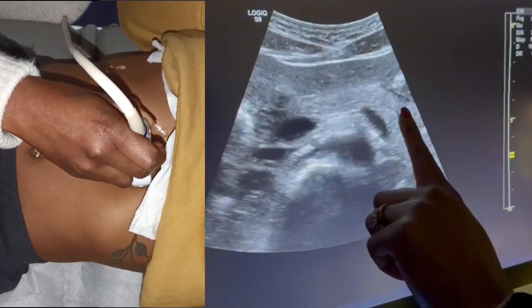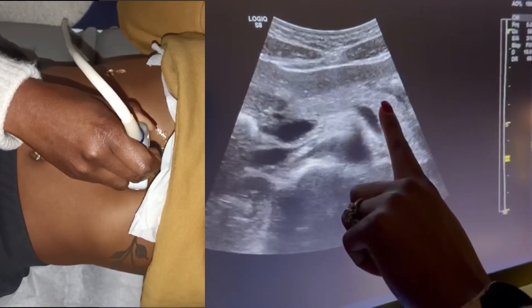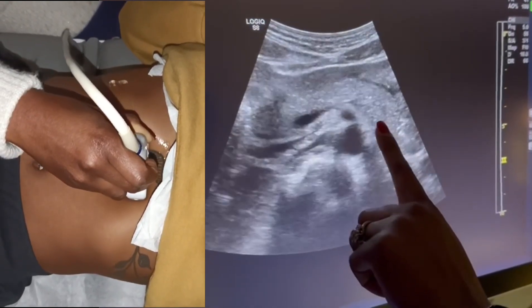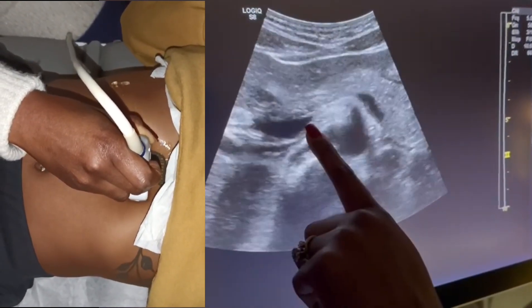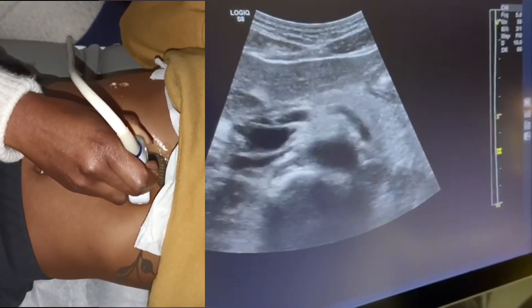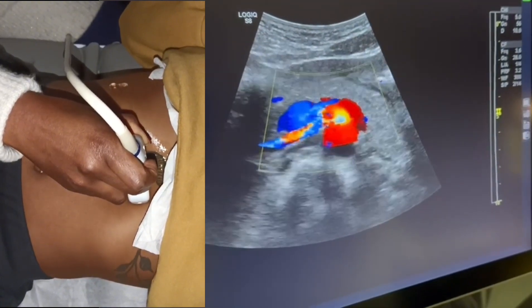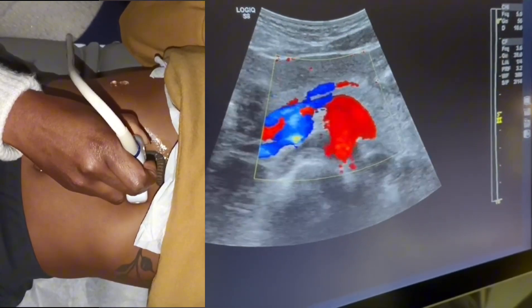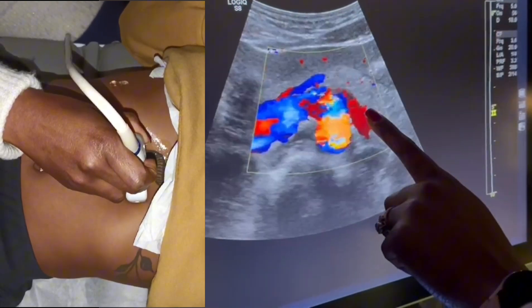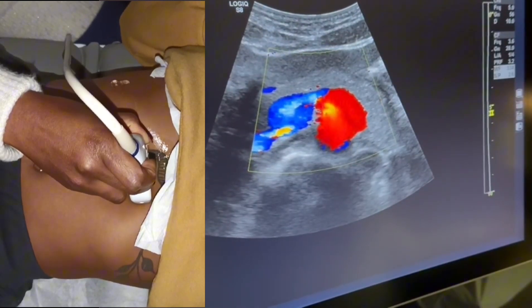Looking at the pancreatic head, you can see the pancreas and the window I'm using. You can see your splenic vein coming in this way, your portal confluence, and your superior mesenteric is right about there. I'm going to go straight into Doppler. You can definitely get a good look at the splenic vein using this anterior approach, and I'm just going to put it in Doppler.